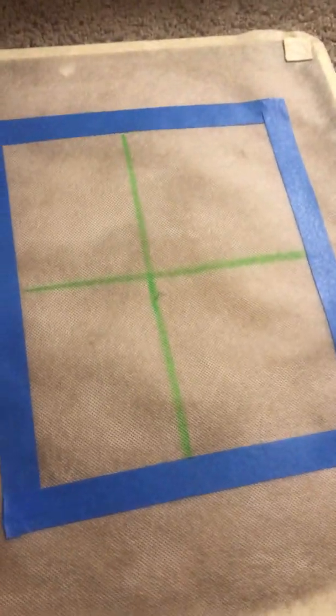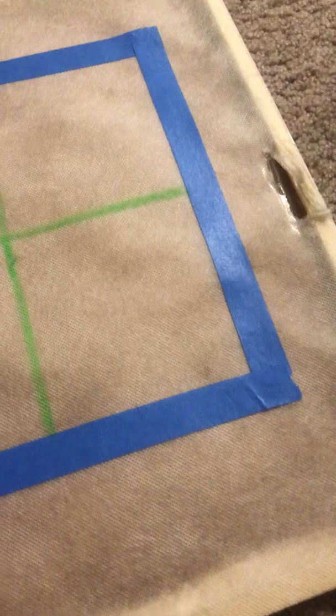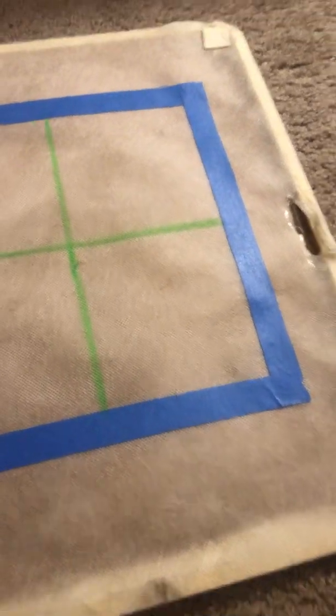So now we're going to be doing x-ray positioning for the lower leg and the knee. First, I'm going to be showing the AP of the lower leg. Now, this is going to be AP position and a line through the malleoli, parallel to the film space.